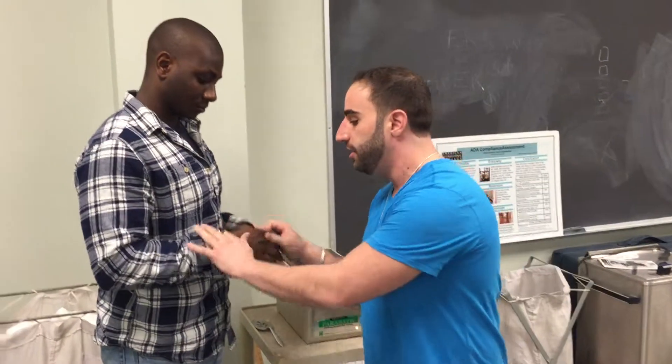The first thing you want to do before starting this modality is make sure that the patient washes their hands thoroughly. You also want to check the skin for any open wounds or cuts, because you obviously don't want them dipping their hand into a hot wax solution if that's the case.